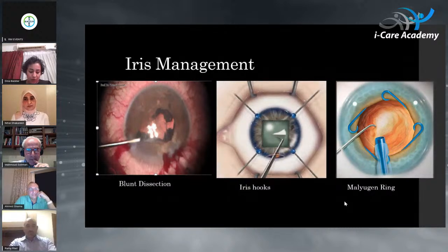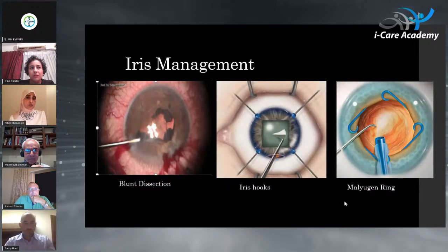Okay. Dr. Nihal, how do you manage? Well, sometimes there is a sort of an epilenticular membrane. When you remove this membrane, the pupil dilates, and sometimes not. So you have to go for iris retractors, and then I complete surgery. It has an advantage that it's a sort of mechanical stretch to the iris. After surgery, there's no fixed dilatation of the pupil when you use these iris retractors.